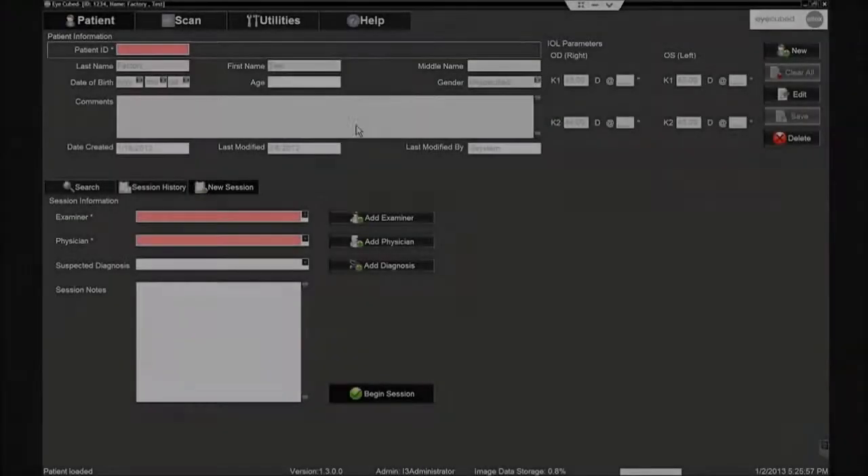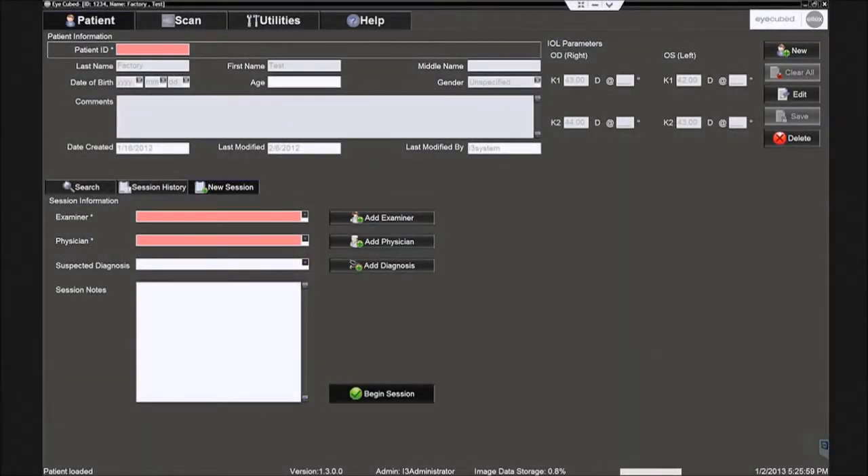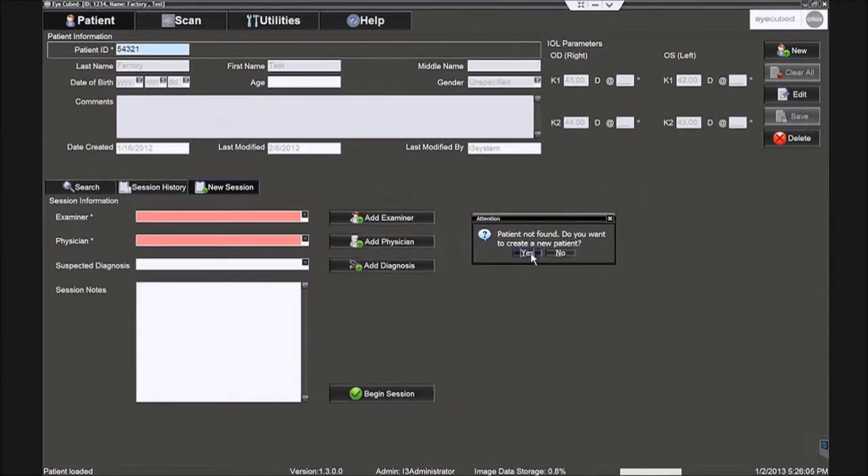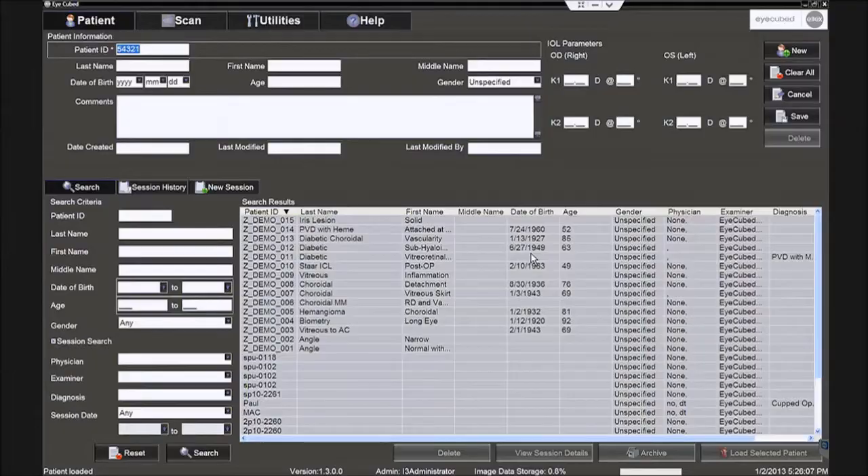The patient screen is displayed. Type a patient ID and click Enter. With an existing patient, the previously entered data will automatically display. Entering a new patient ID prompts the user to answer yes to creating a new patient.